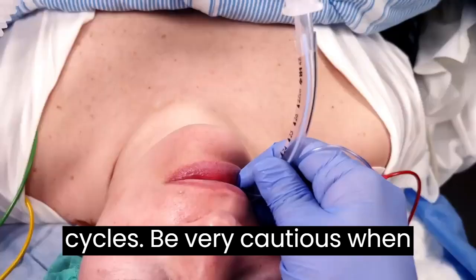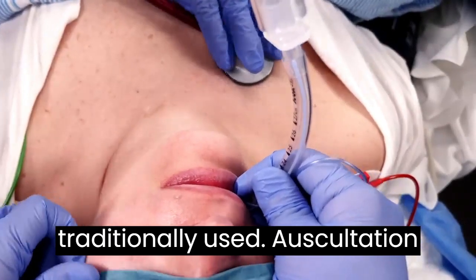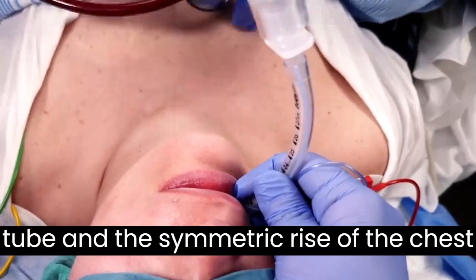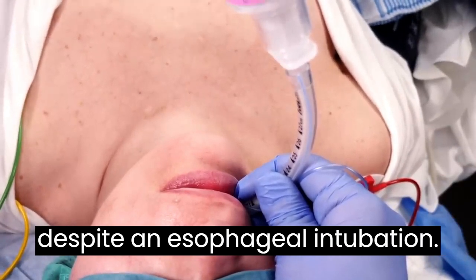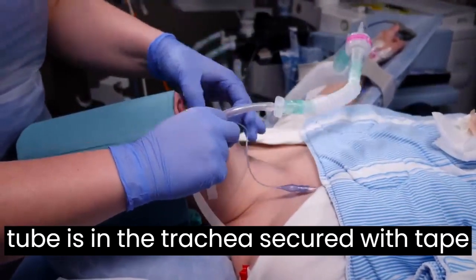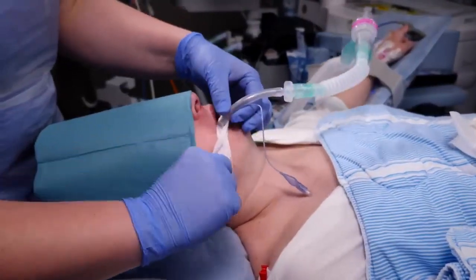Be very cautious when interpreting the other signs traditionally used: auscultation finds on both lungs, condensation in the tube, and the symmetric rise of the chest wall, as these may very well be positive despite an esophageal intubation. When you're absolutely certain that the tube is in the trachea, secure it with tape and initiate mechanical ventilation.